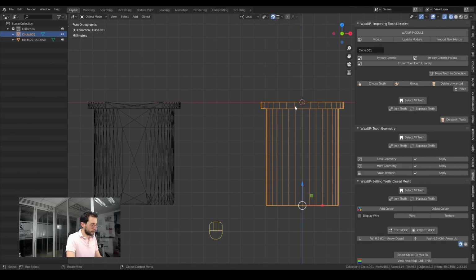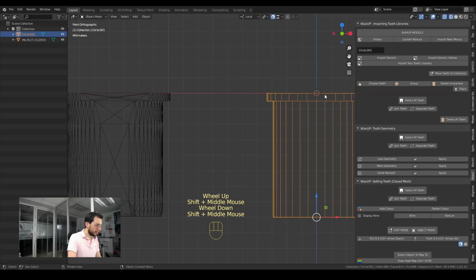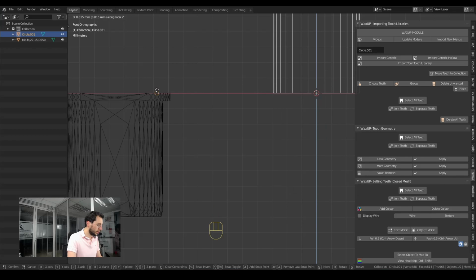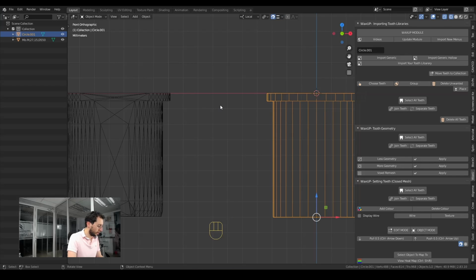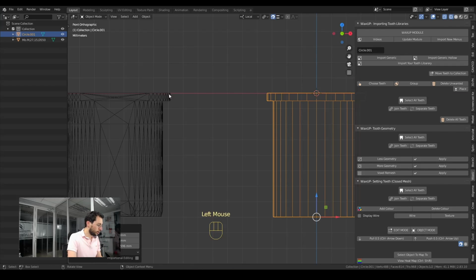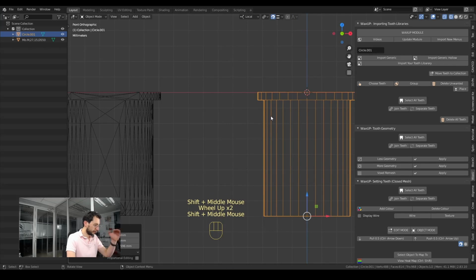So in order to have this element at the exact same spot, I can use my snap option, which is still active. I press G and Z to move it in the Z axis. And when I get here, okay, one detail, I have to choose closest. Okay, now G and Z. And now when I get to here, it will align flush with this element exactly in the same height.